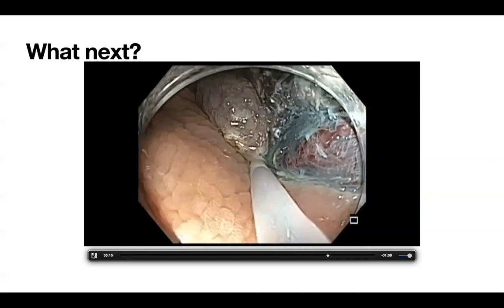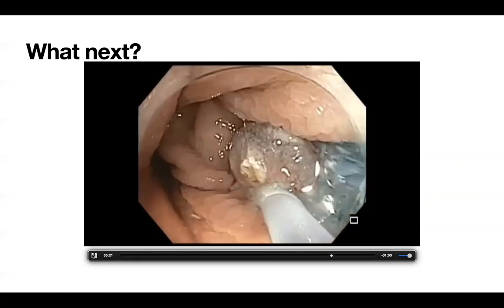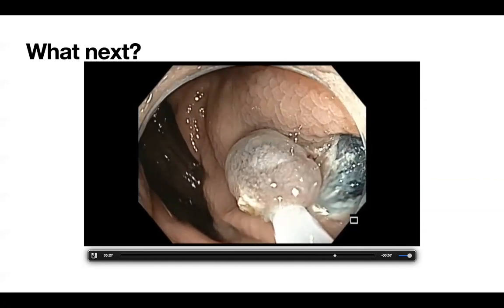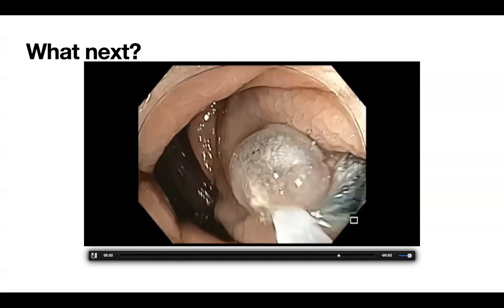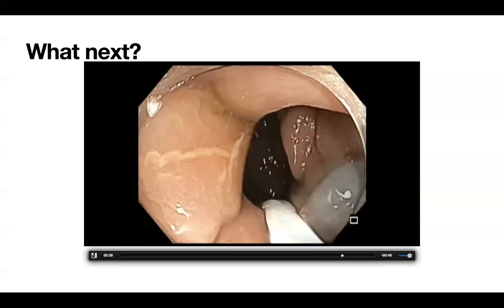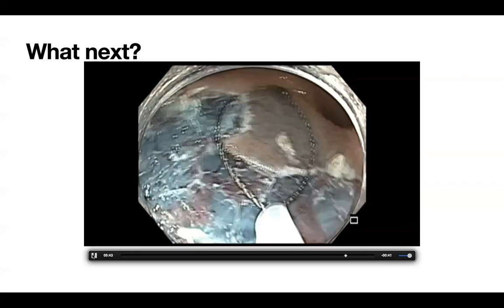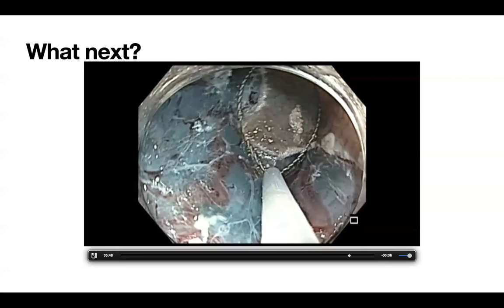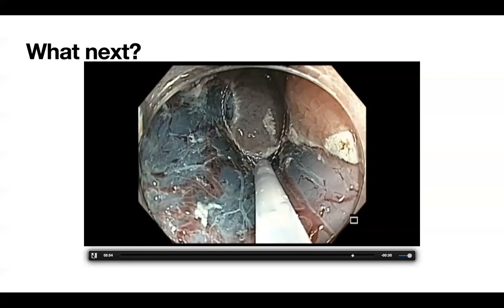Generally, if it is a sessile serrated lesion, they are softer lesions. They are not firm, snare-slipping kind of lesions. So the fact that there is some difficulty in capturing this mucosa on this side, that leathery appearance, etc., does give me some suspicion that the main polyp is not the sessile component, but this additional component is a prolapsed mucosa with some amount of submucosal fibrosis, because this polyp was not intervened previously to expect any adhesions related to a prior attempt.